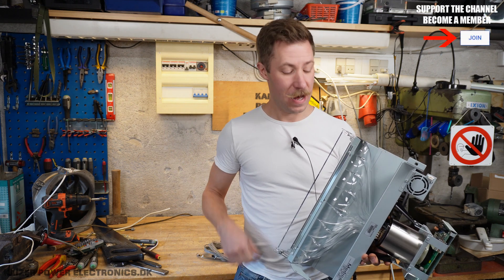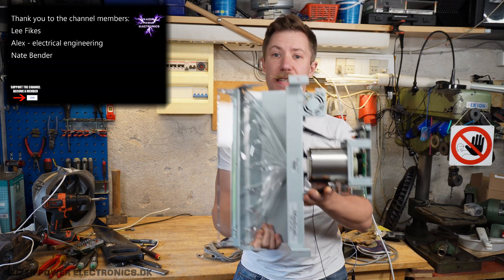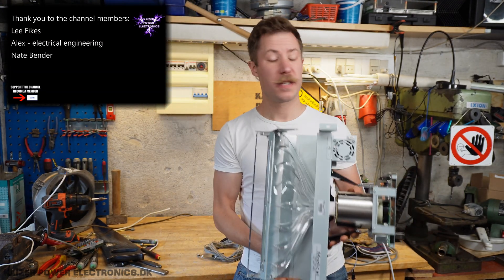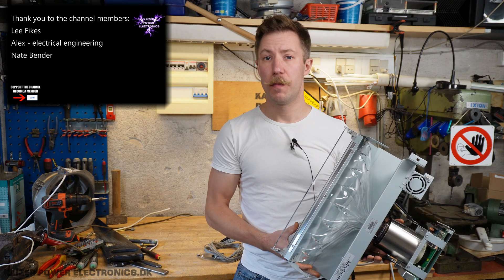Hi all, I'm Mads Baunkamp from Kaiser Power Electronics, and what I have in my hands here is the world's most light-sensitive device, which is a photomultiplier tube.